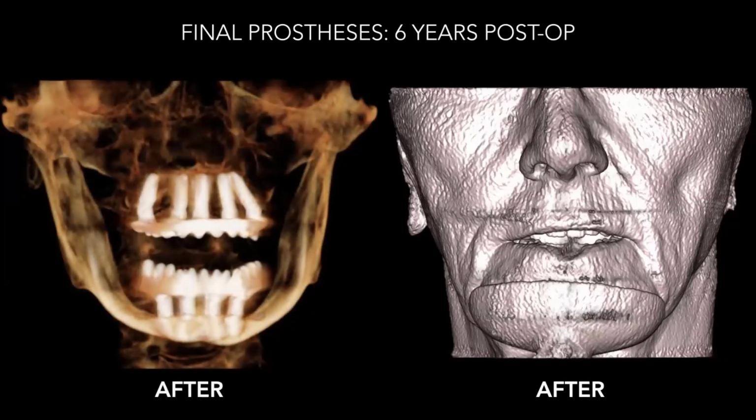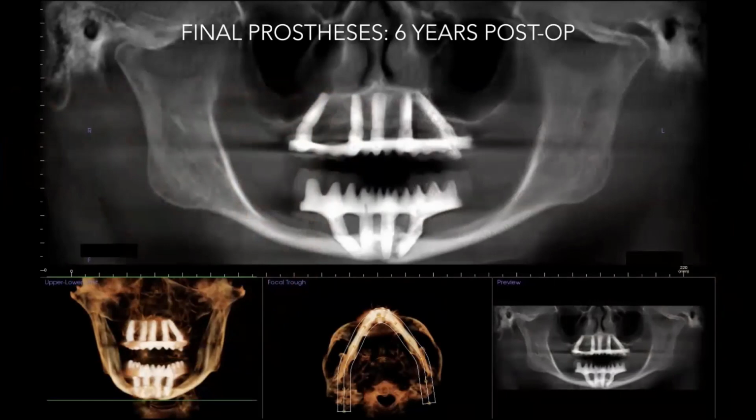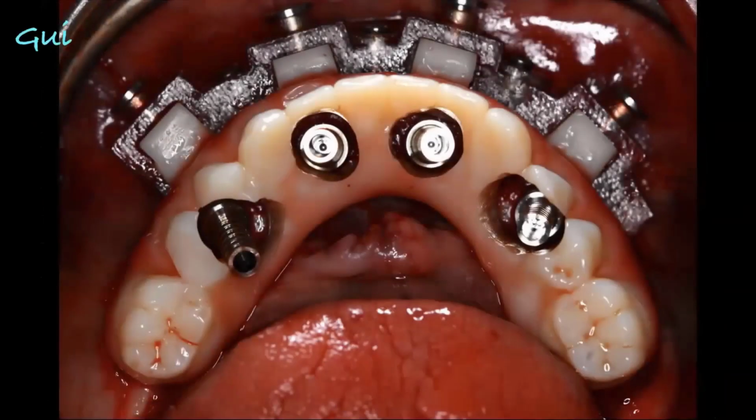And the images, like I said, come directly from the machine and directly from the scan that you take. It isn't somebody else's mouth; it's her mouth. So she knows what's going on in her mouth, and she sits down every year. Every year we take a CT and take images of her implants to maintain them, and we look at them together, and we spend the time to make sure that things are the way they should be and continuing to be stable.